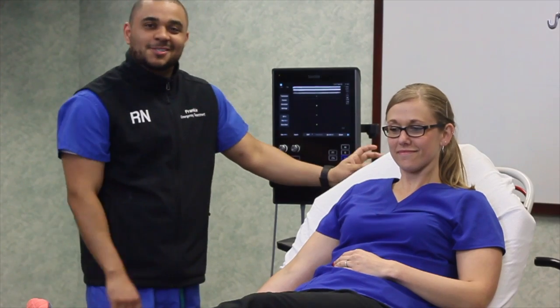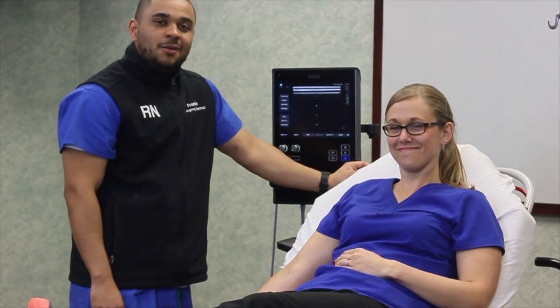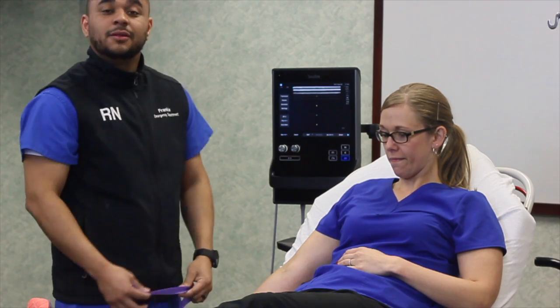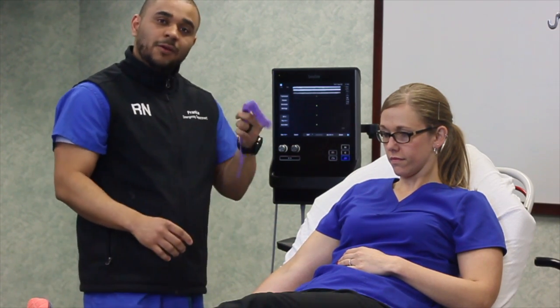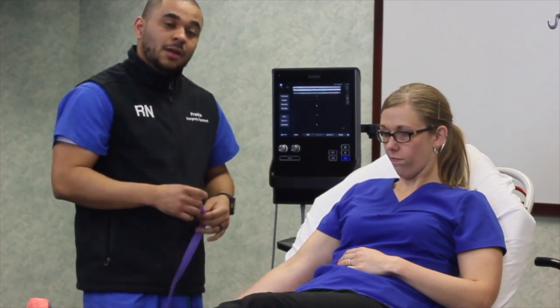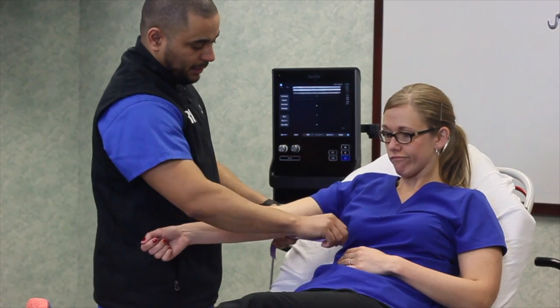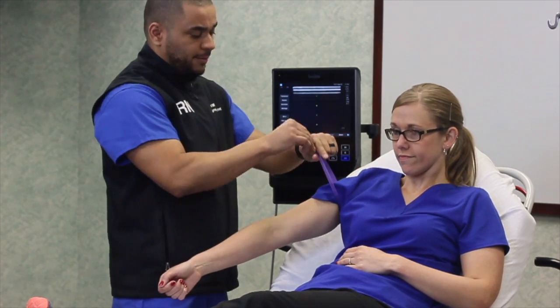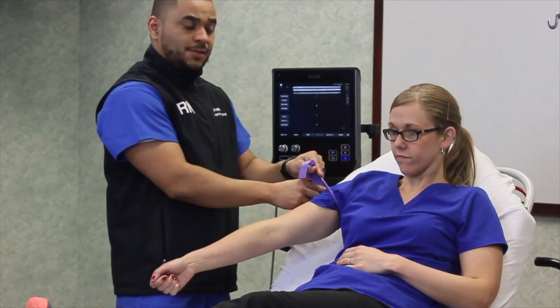Now let me welcome Ashley, who is playing the role of our patient. We've inspected her arm, palpated as much as we can, and decided to bring the ultrasound in because we can't find anything obvious on her upper extremity. Let's talk about tourniquet placement — traditionally we place it a little bit lower, but for ultrasound we need to go a little bit higher.